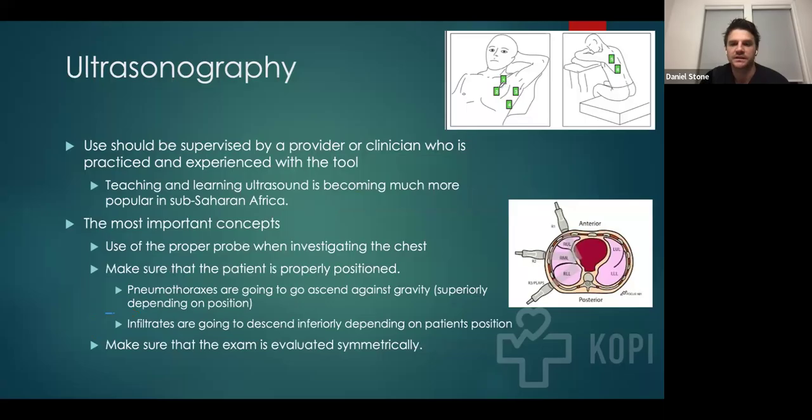The way to ultrasound a chest is usually a 6 point exam. A 6 point exam basically implying that there's 6 points within the chest that you can actually evaluate. So there are two lateral, two anterior, and then two posterior in this. There are other people who just argue a 3 point exam, just basically evaluating an individual in the 3 planes, so anterior, lateral, and then posterior. And that's fine too. Some people say, you know, you want to take a look at the apices and the bases.